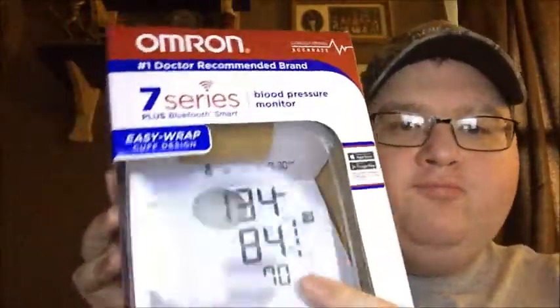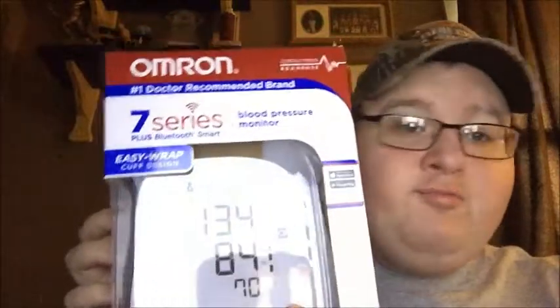I guess they put this little sample here showing what your normal blood pressure is supposed to be. It's Bluetooth Smart — I haven't even tried to link this to my phone yet. It's got advanced accuracy and an easy-wrap cuff. Yeah, 'easy wrap' for skinny people — I tried to put that on and the damn thing popped off.